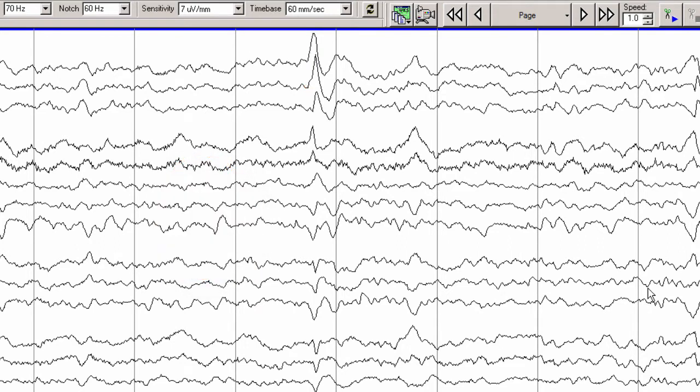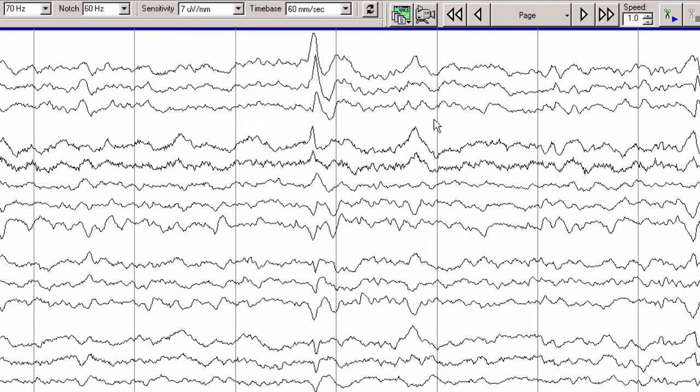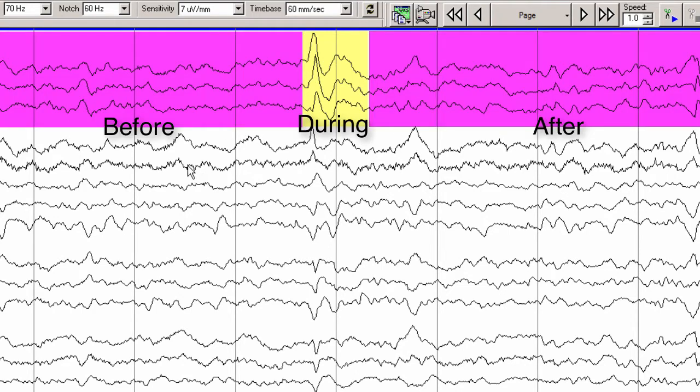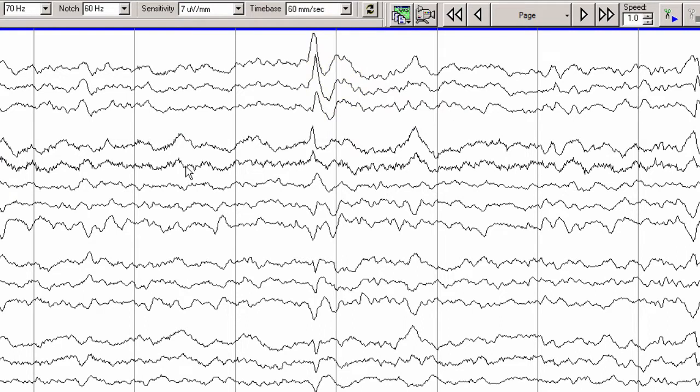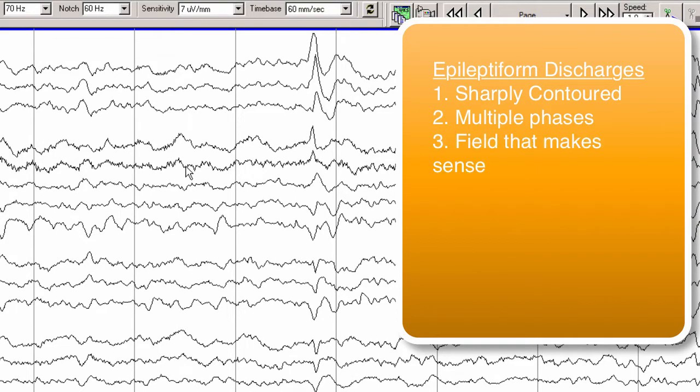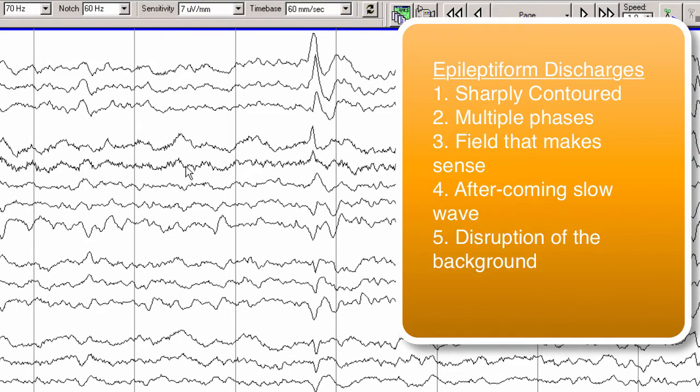You can also note that there is a disruption to the background. Here we see the sharp wave which has at least three phases, followed by a return to the baseline background. During the epileptiform discharge the background in the left temporal region is very different than the background that is seen before and after. This follows all of the rules of an epileptiform discharge in terms of being sharply contoured with multiple phases, with a field that makes sense, with an aftercoming slow wave, and with disruption of the background.